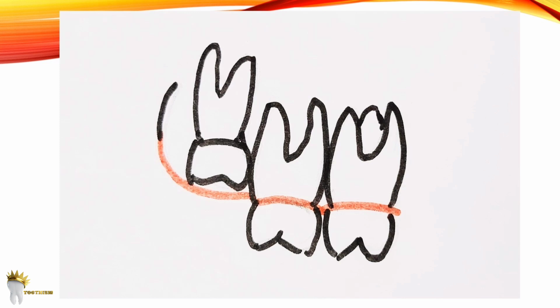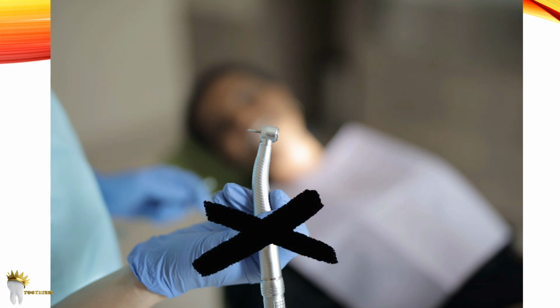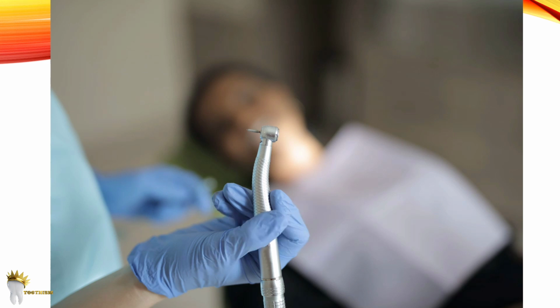For maxillary teeth, usually bone removal is not necessary, but when it is required, bone is primarily removed from the buccal aspect of the crown down to the cervical line to expose the entire clinical crown. Another important point in bone removal is one should never use the regular handpiece that we use for restorative dentistry. We need a straight handpiece. The reason is the straight handpiece has higher torque, which results in more cutting efficiency and less heat at the bone to burr interface. So a straight surgical handpiece is a must for bone removal.